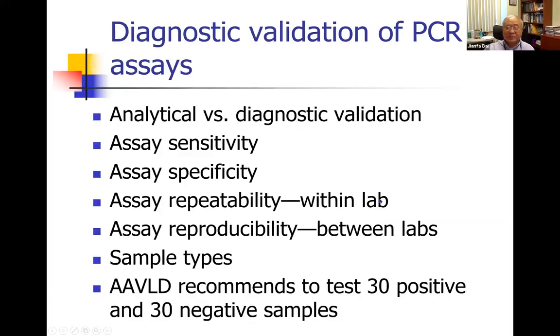Then after that, you do diagnostic validation. You use real diagnostic samples to figure out diagnostic sensitivity, specificity, repeatability, and reproducibility, and verify what kind of sample should be used for the assay. The AAVLD is a society that certifies diagnostic labs in the US and Canada, and they recommend testing 30 positives and 30 negatives before you provide the service. So we are following their suggestions in general.